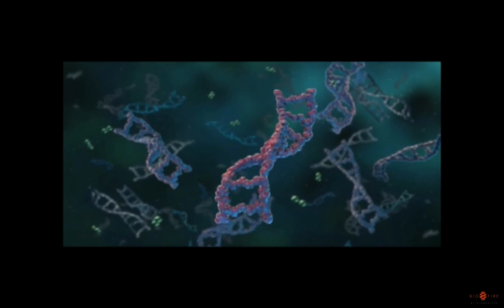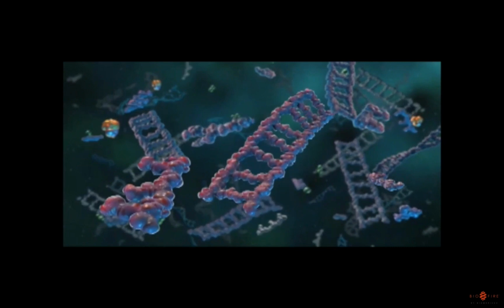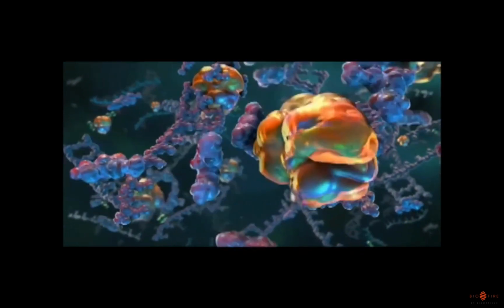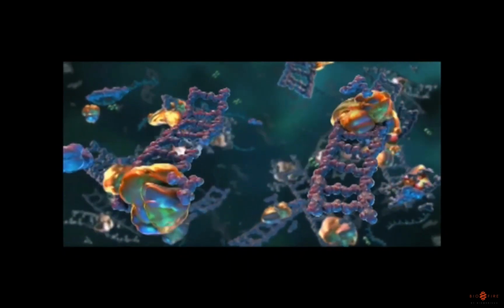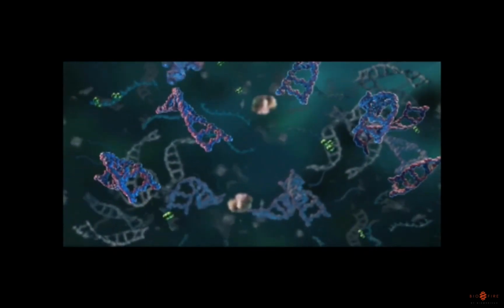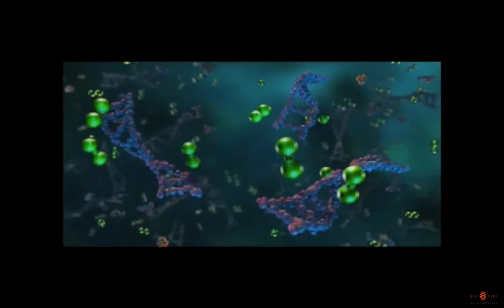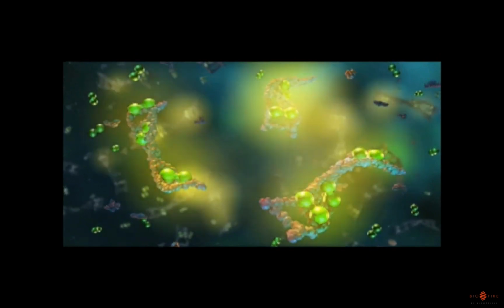Each well of this array is pre-spotted with one pair of second stage PCR primers. These second stage PCR primers are designed to amplify sequences contained within the products from the first stage PCR. This eliminates non-specific products associated with traditional multiplex PCR, because the second stage primers specifically amplify only target DNA. A fluorescent double-stranded DNA binding dye is used to monitor each reaction.